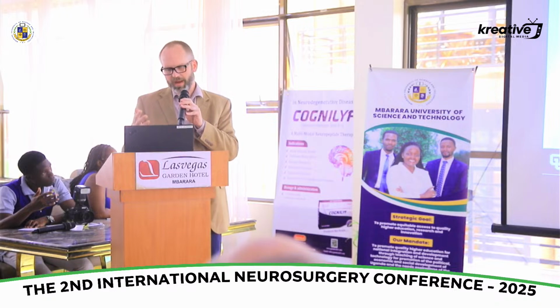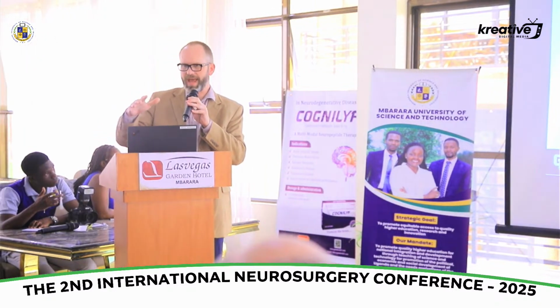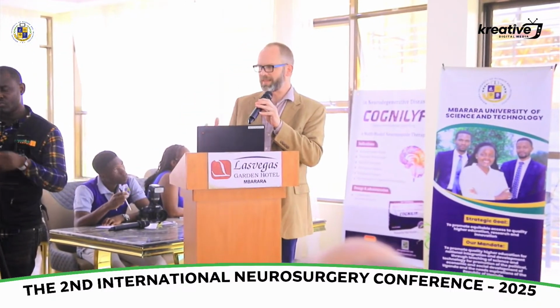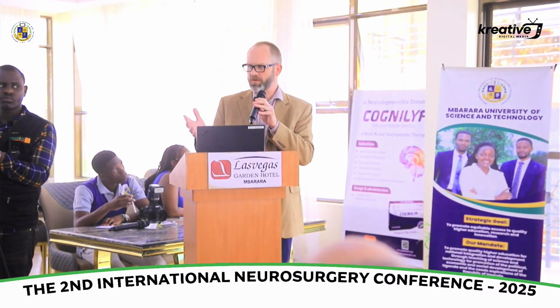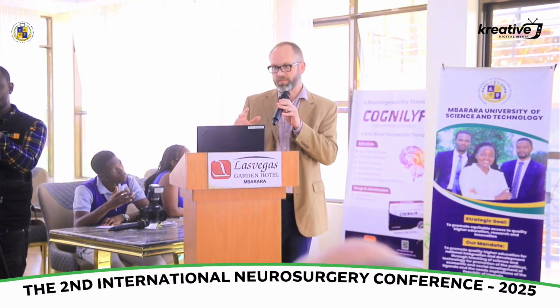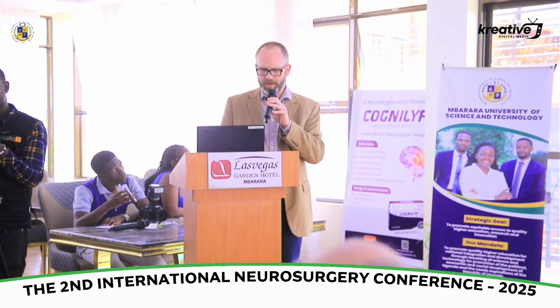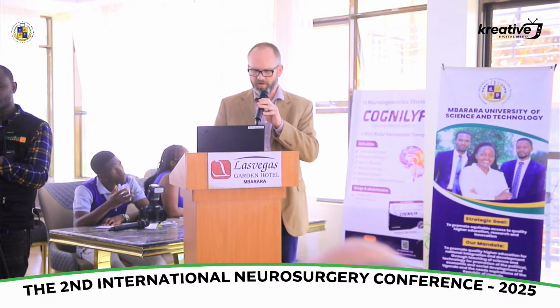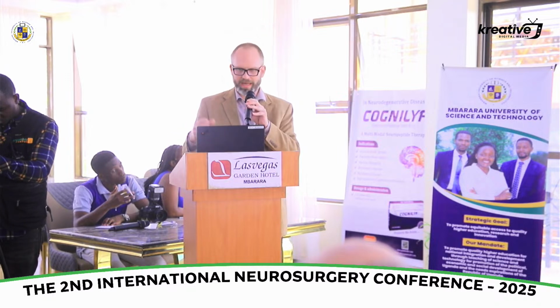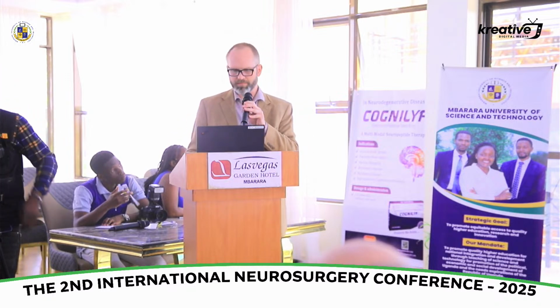What I recommend for people is, if you have a radiologist who deals with pediatric patients with head ultrasound, having them come to the OR with you to help with interpretation early on is very beneficial. If that's not available, then we'll talk about some hints to help you through that learning curve. But the key is to just bring it into every case, to practice, and you'll get better.